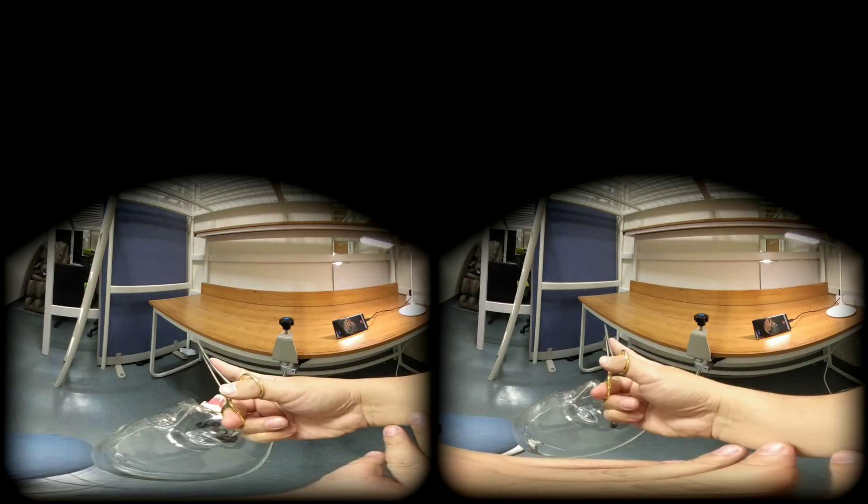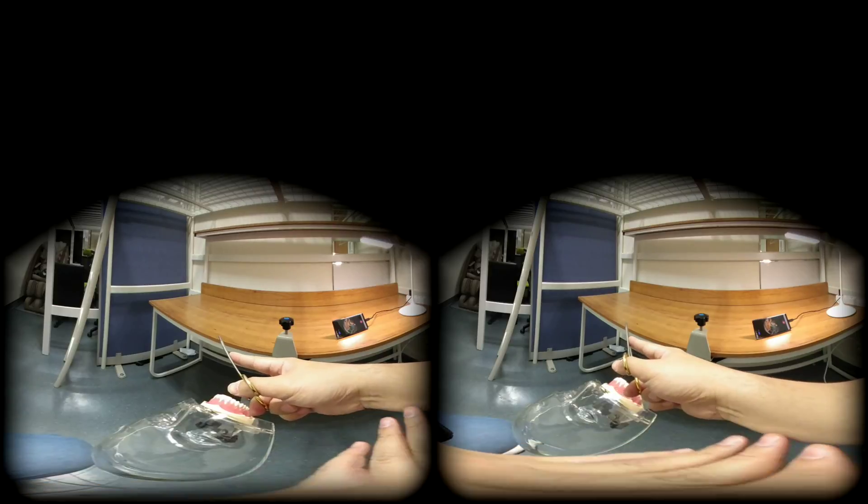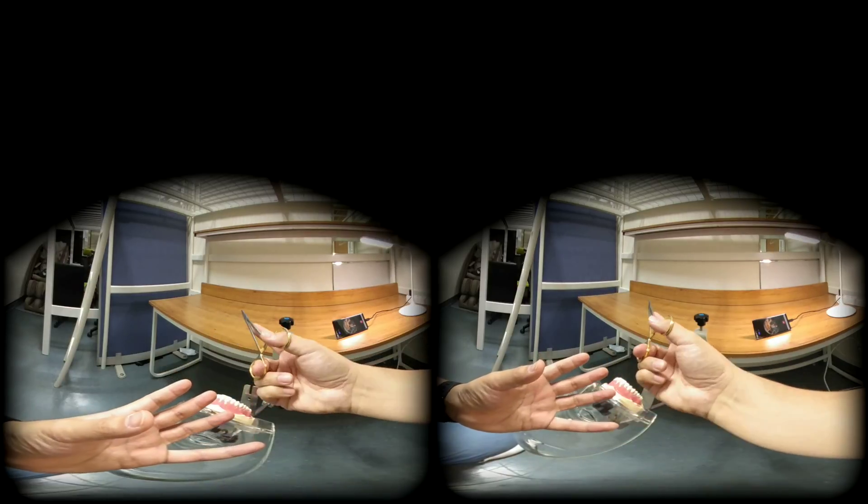Your wrist moves in these directions and this is the tripod grip. However, if you move your wrist in these directions, you will feel some restraints and some pain. So this tripod grip limits your movement.